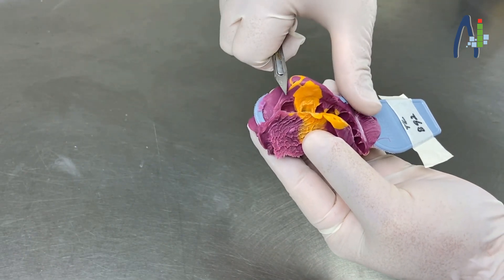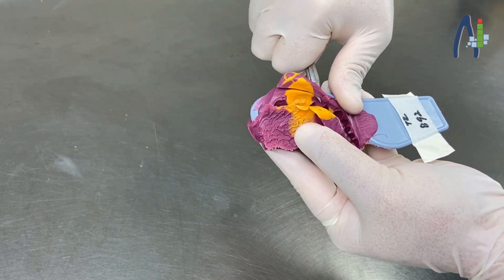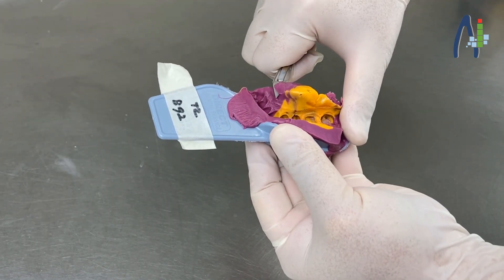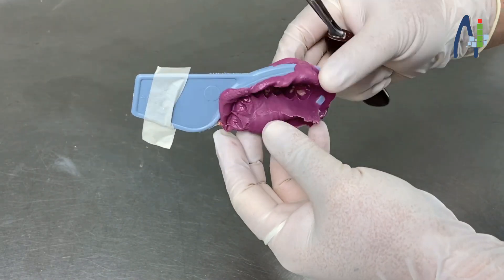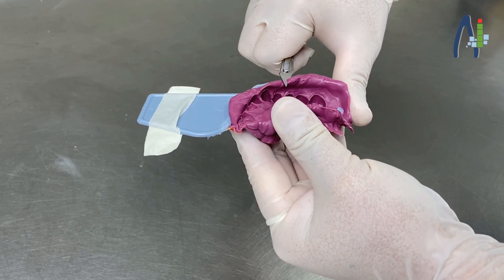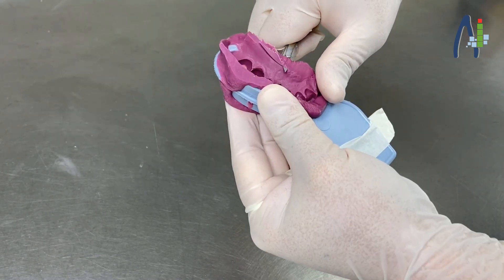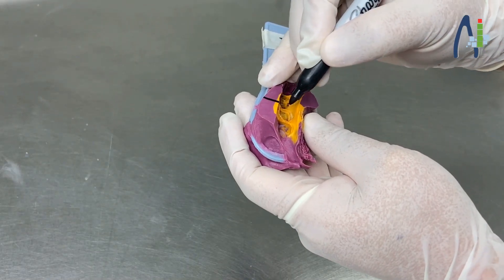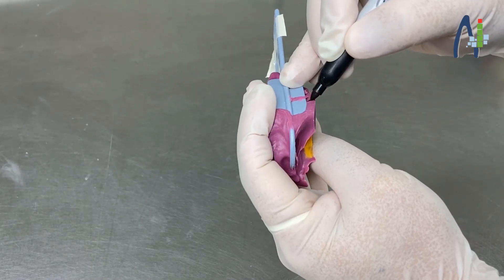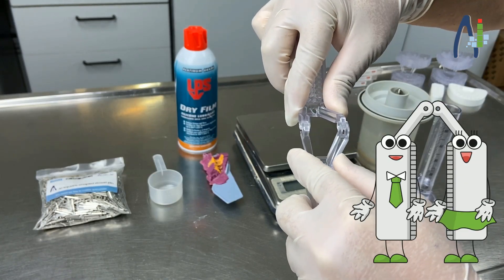Before we start, you should cut the edges on the impression. Don't forget to cut the edges on the other side. Please mark where you are going to place the pin on the impression. Then snap both sections together.